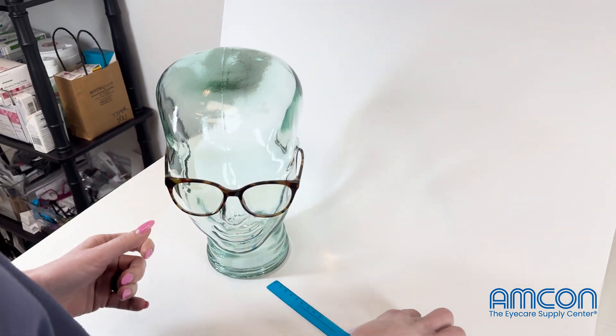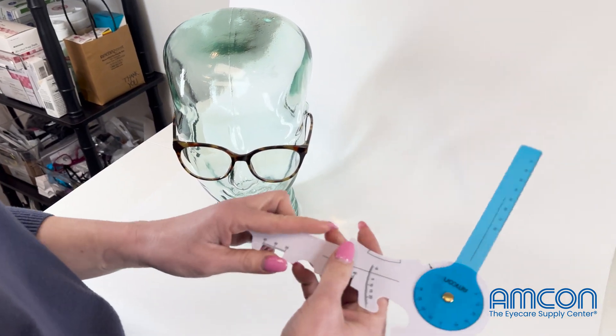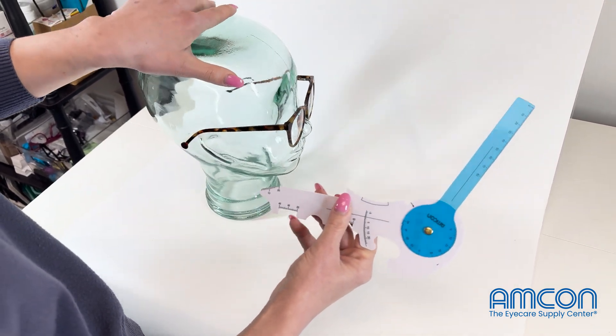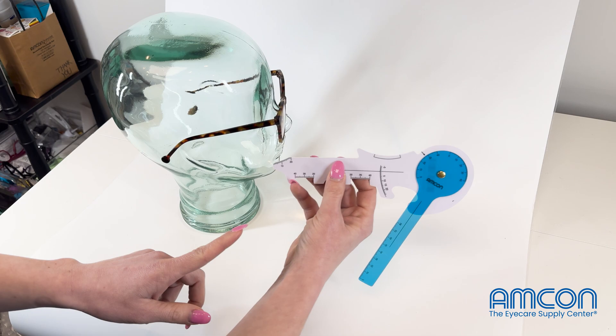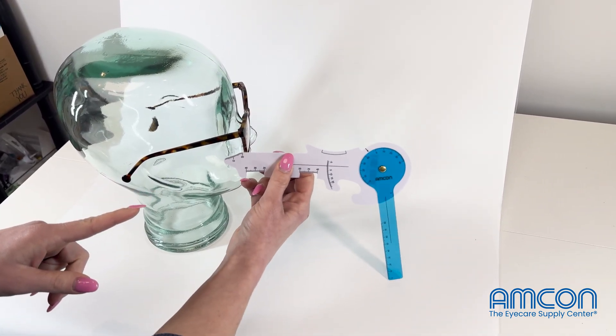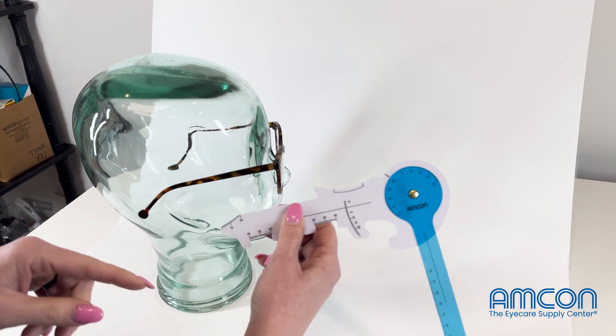For vertex distance, you're going to use this little attachment here. What you're doing with that is trying to get the distance between the surface of the patient's eye and the surface of the back of that lens — that's your vertex distance.